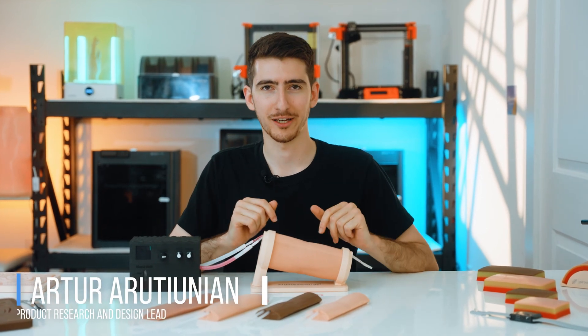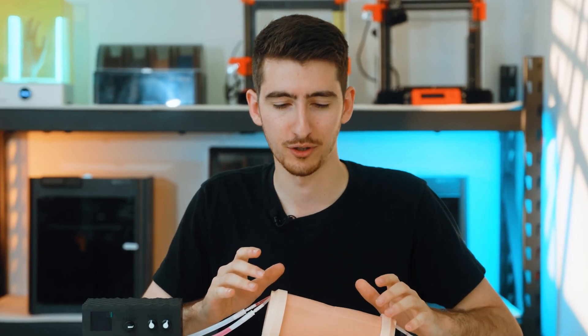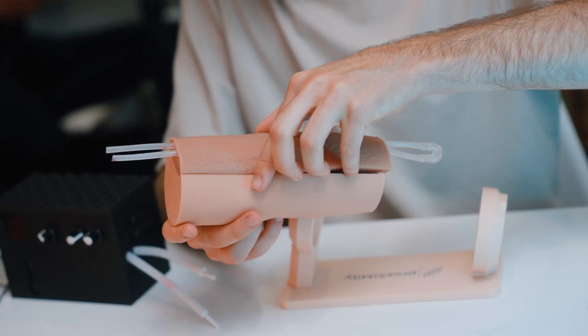We are at Proximity Headquarters. My name is Artur and I would like to show you our venipuncture model. What is very unique about Proximity's venipuncture model is that it comes with 5 different patients.